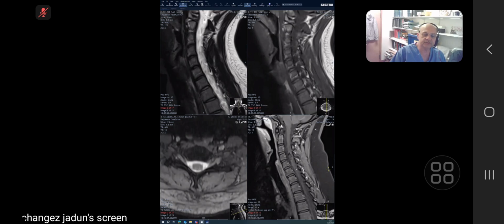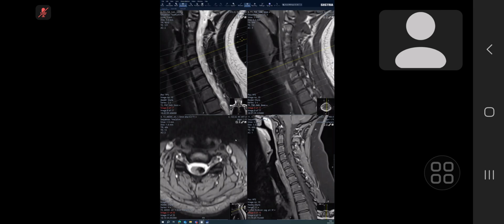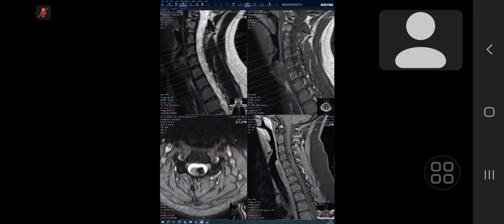But anyway, you have given me the description so far, but you have not given me the differential diagnosis of this lesion. Yeah, in the differential diagnosis, this could be a small cavernoma, because there is a marked hypointense rim on T2 weighted images, which I can see, and which appeared more pronounced on the gradient.